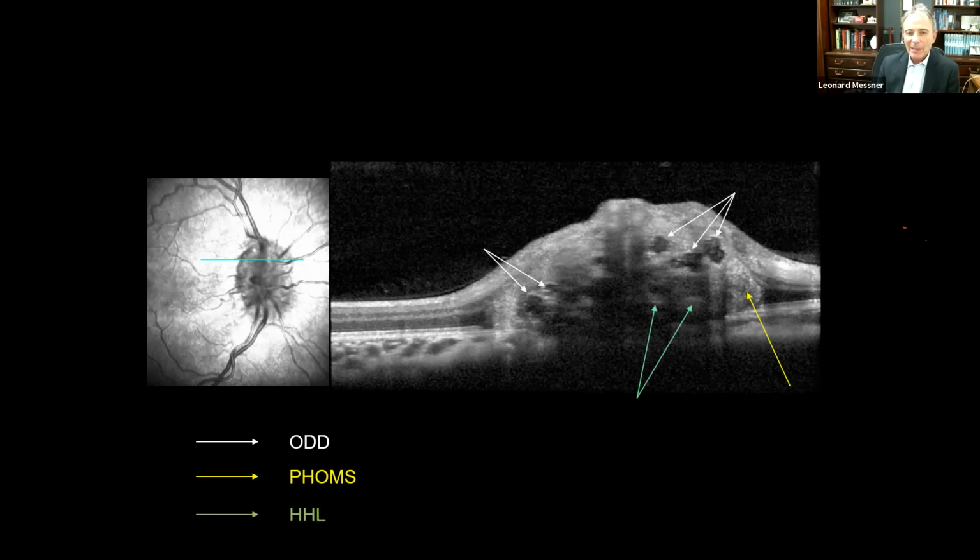Here we can see these hyperreflective horizontal lines within the substance of the optic nerve. And just for the sake of comparison, I'm circling the retinal blood vessels here. Now, some individuals will mistake blood vessels for Drusen. You don't want to do that, but you don't have to. Vessels are always very, very superficial within the optic nerve. They do a tremendous job of shadowing everything posteriorly. Drusen shadow a little bit, but not nearly as well as retinal blood vessels.